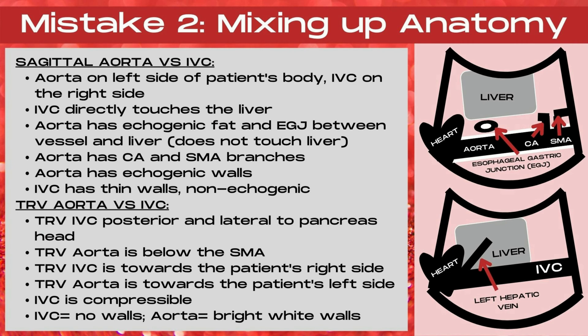In the top image, you'll notice the EGJ — this is the esophageal gastric junction — lies in between the aorta and the liver. There's also going to be echogenic fat in this region, and you'll note that the aorta does not directly touch the bottom surface of the liver. While in the bottom image, the IVC is going to directly connect with the bottom surface of that liver, and you'll also see the left hepatic vein coursing out of the liver.